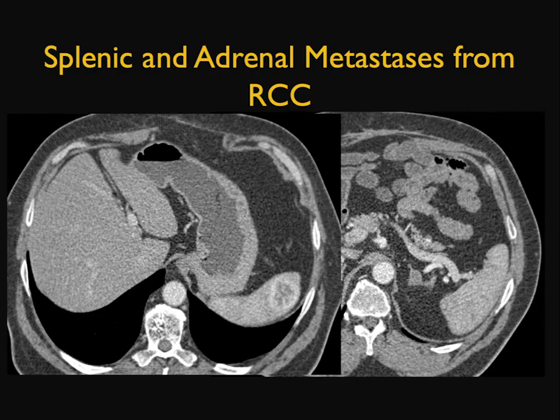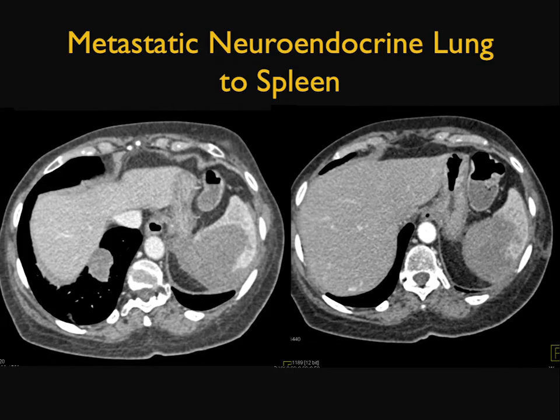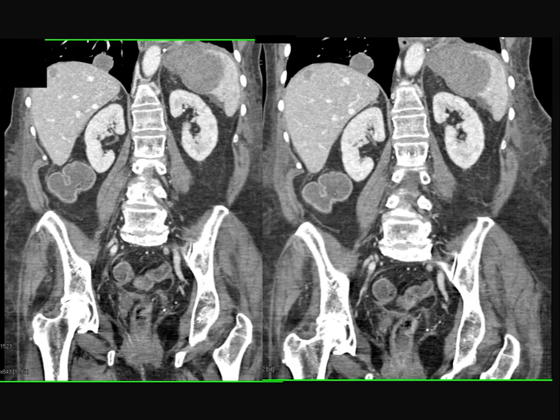With renal cell carcinoma, the patient has mets to the spleen and mets to the adrenal. Remember, clear cell renal cell carcinoma — mets to pancreas, mets to spleen, mets to liver, mets to stomach, mets to soft tissue and muscle — are all typically hypervascular, so that can be helpful. Another example: neuroendocrine tumor of the lung, metastatic to the spleen. You can see it's extending through the spleen, with mets to the right lower lung as well. Metastases are going to be more common than a primary splenic lesion.